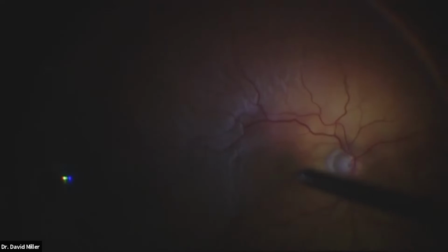Okay. And the point of this is going to be to mark the retinal tear so we can find it later.